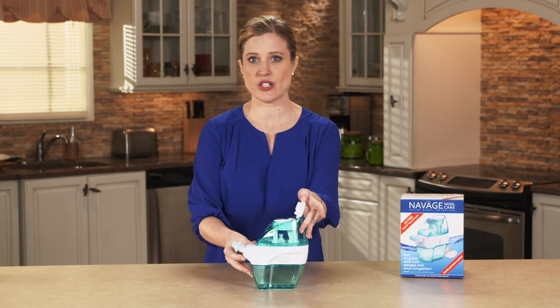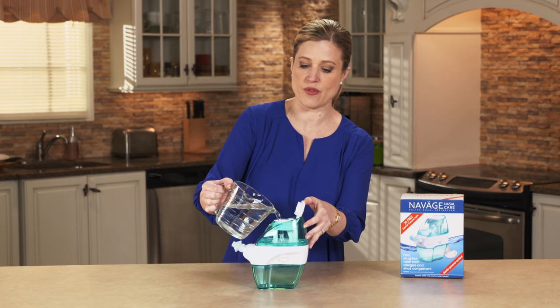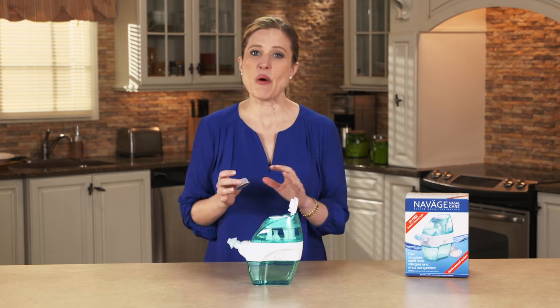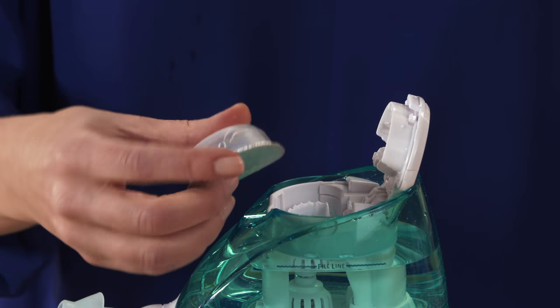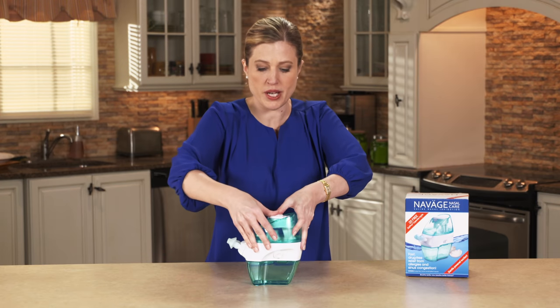Open up the lid to the crushing chamber and then take some water. I like using warm water that's just comfortable to the touch, and you're going to fill it up to the fill line. You always want to start with a new unused salt pod — put it into the crushing chamber foil side down, then close the lid and use both of your thumbs to firmly press down.